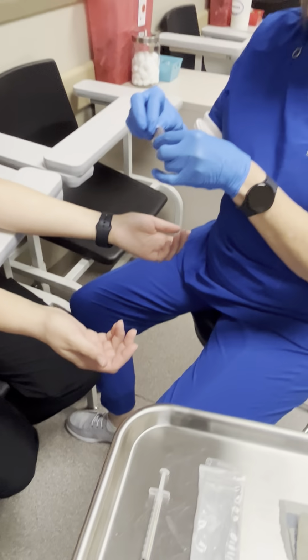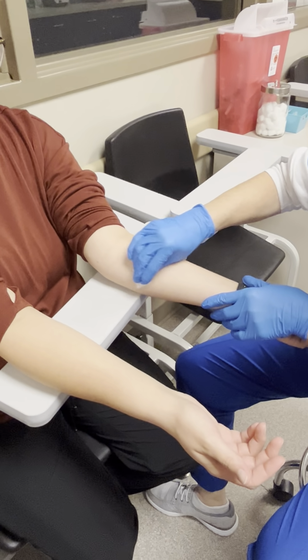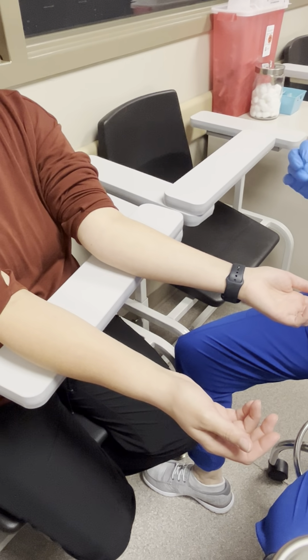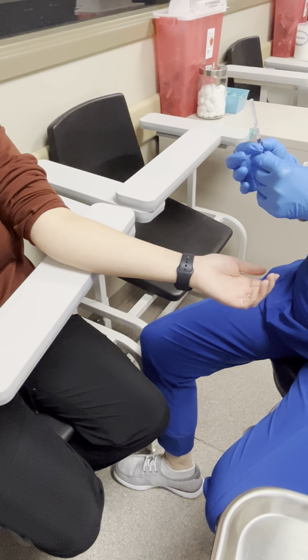So the first thing we do is cleanse this area here in a circular motion, and then we're going to let it dry. While we're doing that, I'm just going to prepare this syringe.